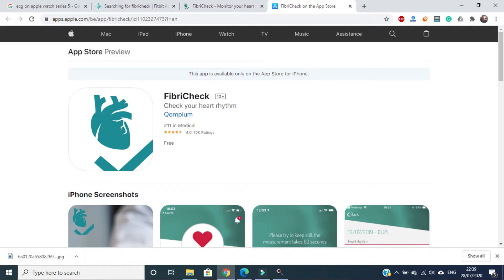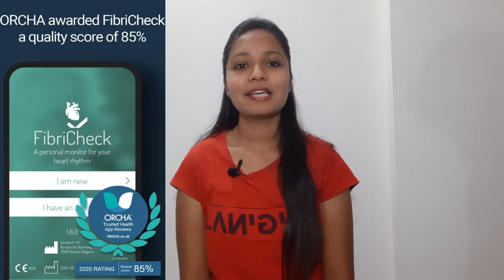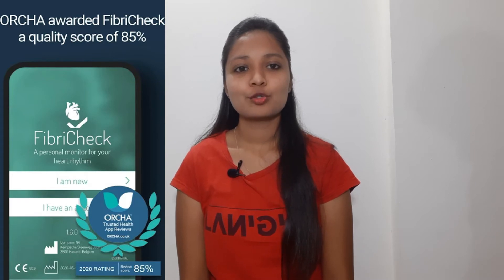Even if Fitbit doesn't allow you to measure the electric activity of your heart, there is one app for it. The app called FibriCheck enables you to use ECG for health screening and monitoring on Fitbit Versa, Versa 2, Versa Lite, and Ionic smartwatches. It is a certified app by CE medical staff, so you can trust it like Apple's ECG measurement.